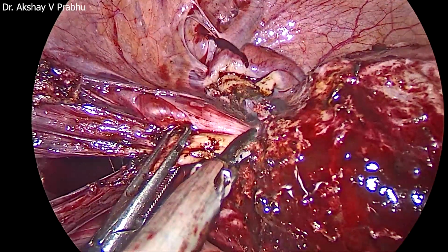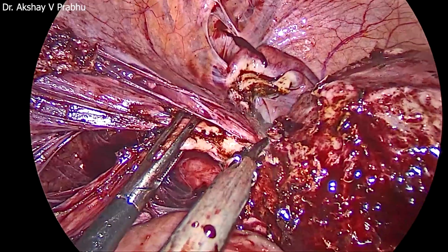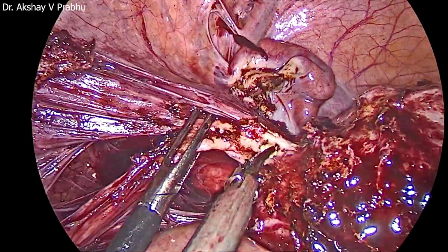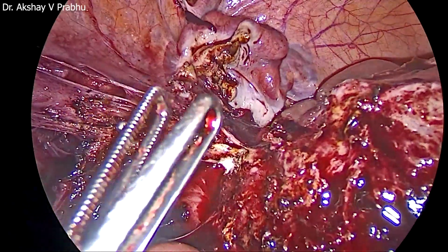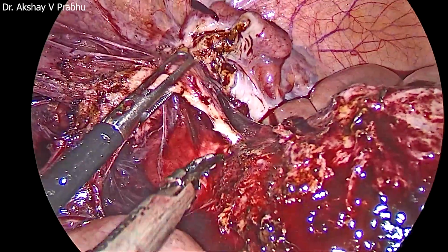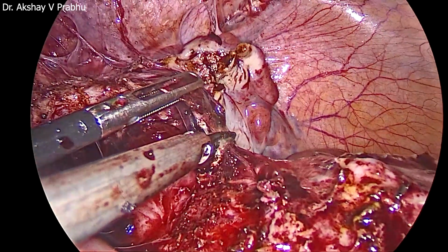What I am holding is actually the bladder. I'm putting it on stretch, the cervix is below, and I'm cutting as much as possible close to the uterus onto the scar tissue. With every cut, you can see that the uterus is going cephalad and the bladder is moving away, caudally. Now a very thin tissue is left behind. You can see the white cervix, that is how a cervix appears. You cannot mistake the identity of the cervix.